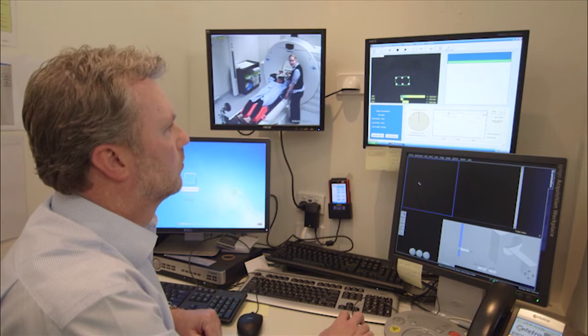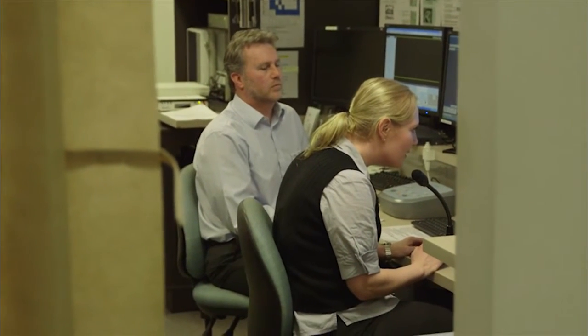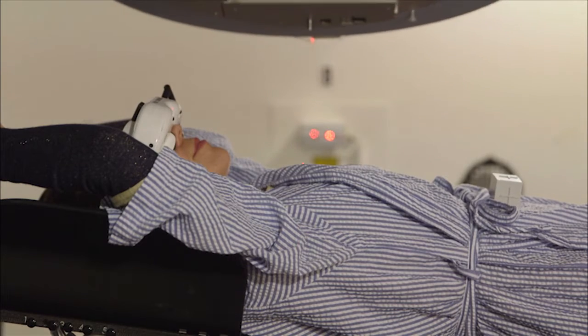So with imaging, they're having you take the deep breaths, anywhere from 2 to 5 breaths of varying duration. And then they'll announce that the actual radiation is going to be delivered. And then it's all done. A session lasts about 15 minutes.